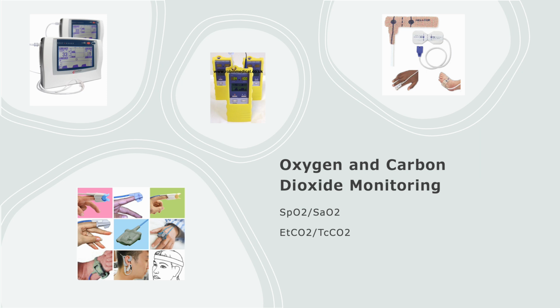But you have to be careful with these because they can burn the skin, so you have to move them a couple times throughout the night depending on how long the study is. Transcutaneous CO2 is abbreviated TCCO2.